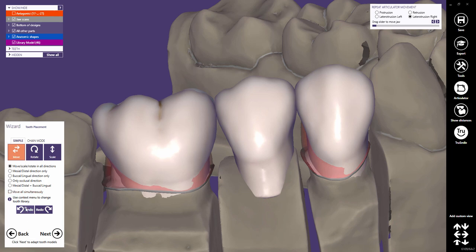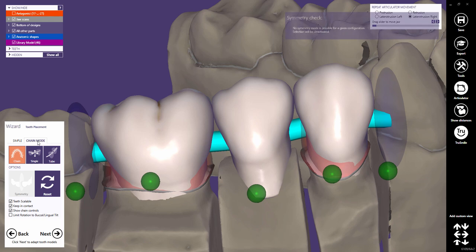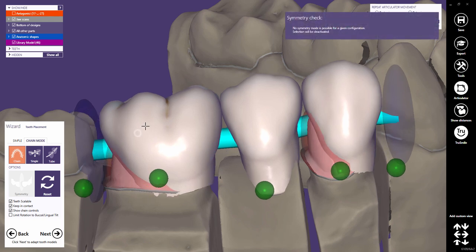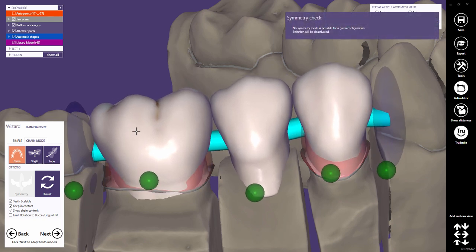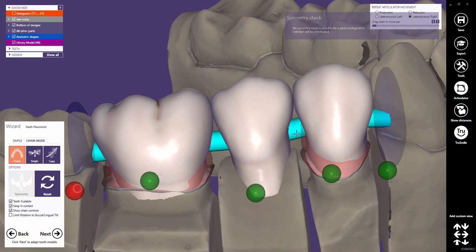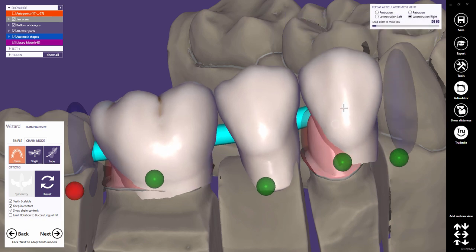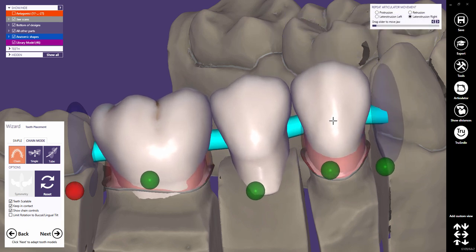Certainly, you can undo or redo all actions. With ExoCAD DentalCAD version 2016, the Chain Mode feature is available in the tooth placement dialog. The Chain Mode is a great tool for full-arch tooth placement — a few clicks are enough to do such a setup. This will be demonstrated in a full separate tutorial.